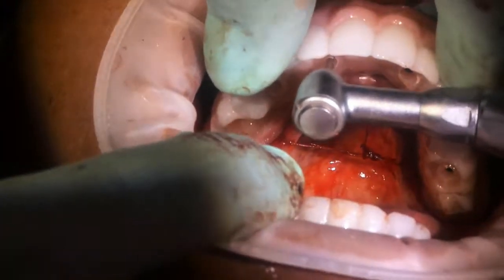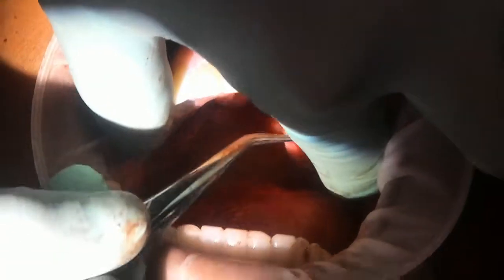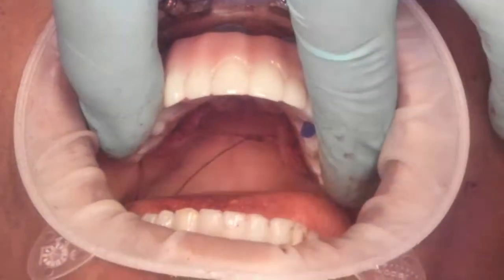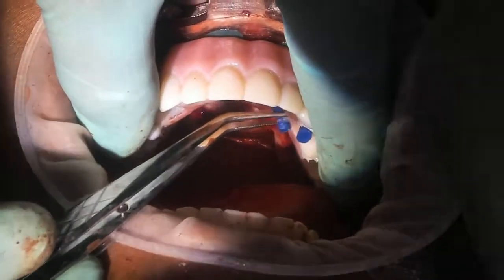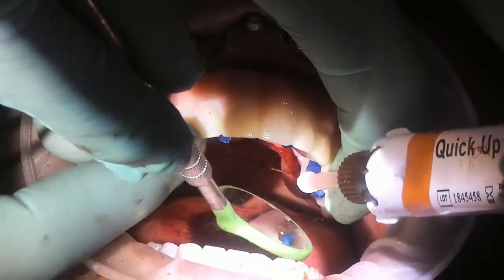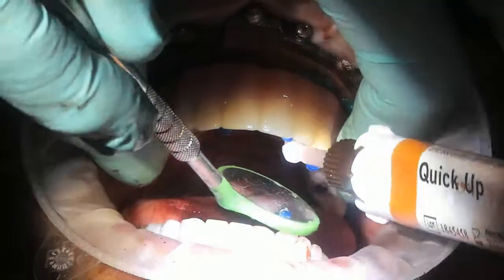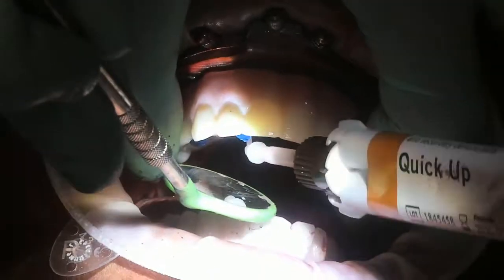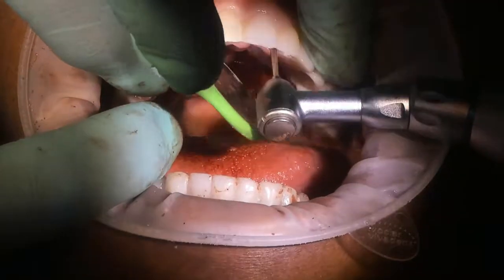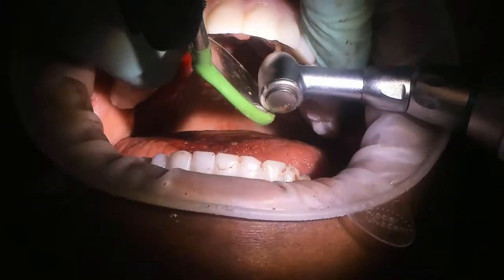Then the prosthetic is removed, and in this particular case, the doctor opted for aesthetic rapid appliances, which means the duplicate of the long-term prosthetic is printed, and we add pink to the labial, and it's an aesthetic rapid appliance that a patient can wear on an ultra short-term basis while we're fabricating the final restorations. So just as you can see here, there's a second pickup process. It's optional, but we do recommend it on every case so that you have an exact duplicate as a backup while the patient is going through the healing phase.